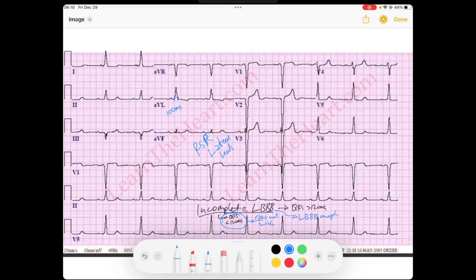If you look at AVL, you get an RS little r prime. Sometimes the RSR prime isn't perfectly evident and it's just more of a slurry upward QRS — you kind of have to see it to believe it. But if you look at AVL, we get that nice RSR prime. Notice V1 and V2 have those deep slurry S waves, though in this case because it's an incomplete block, they're not as slurry as we typically see.